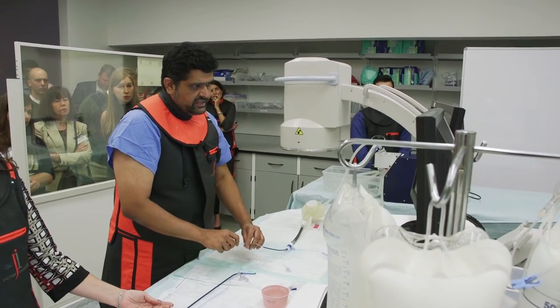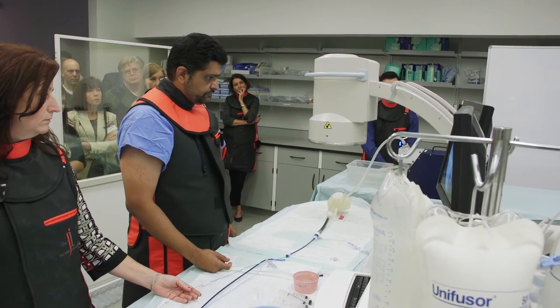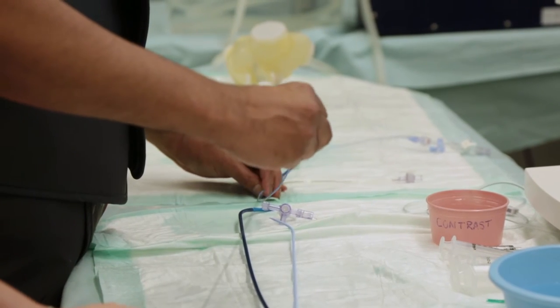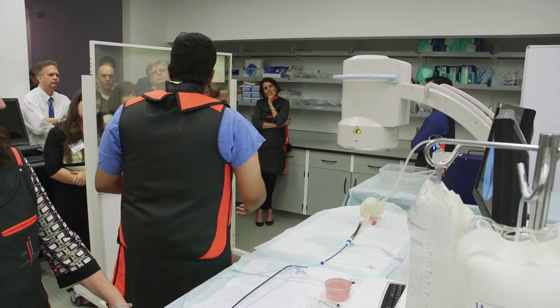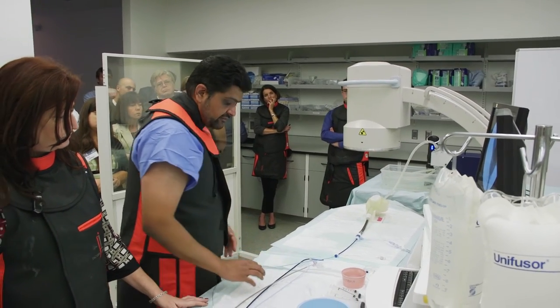I'm not using the bigger sheath here, but we can essentially use this. We can find the appendage using this steerable catheter — we'll move it up, find the appendage, find a good spot, take some pictures, get a good size measurement, and then go ahead and deliver the device. I can't show you the delivery of the device today.